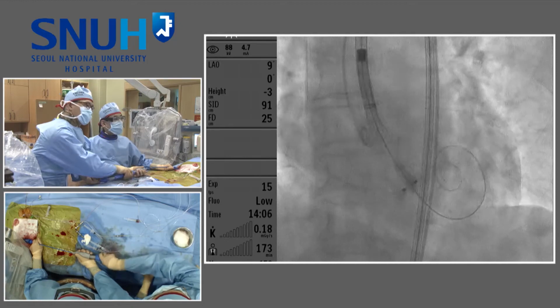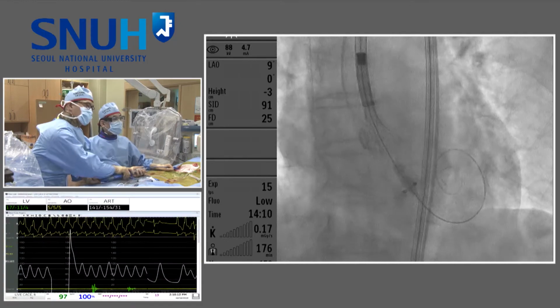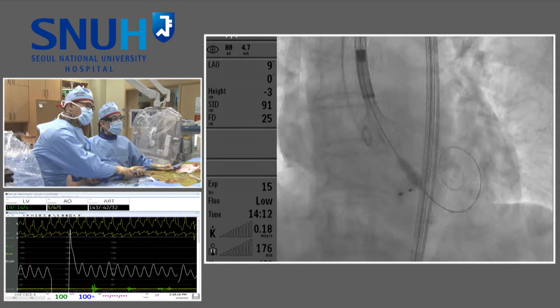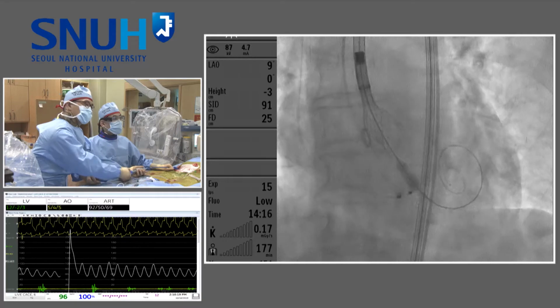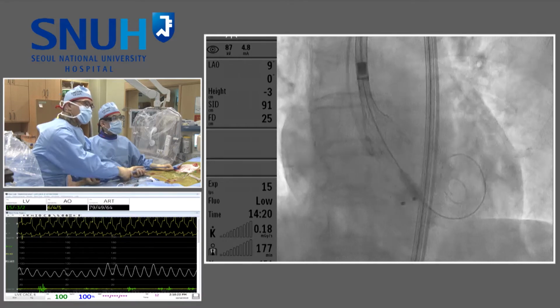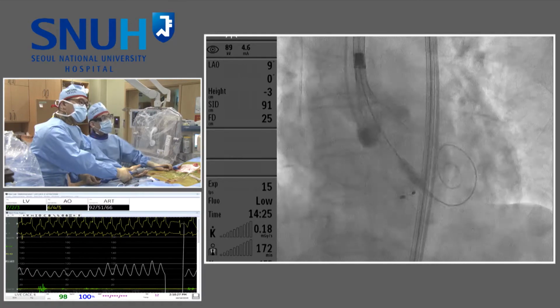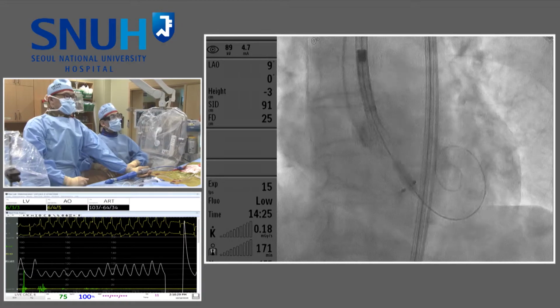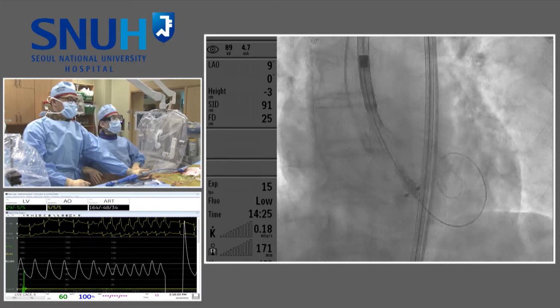Deploy. Deploy. We have a BP drop right now. Deploy. Stop pacing. Testing. Can you see the T?